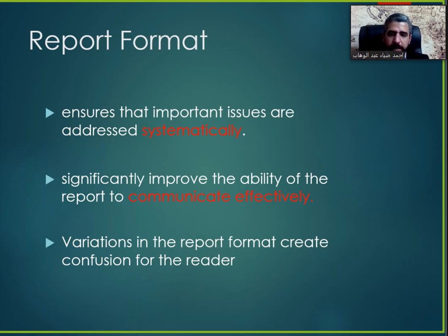If we use the same reporting format, this will ensure that the important issues are addressed systematically, okay? And it significantly improves the ability of the report to communicate effectively, while variation in the report format creates confusion for the reader.